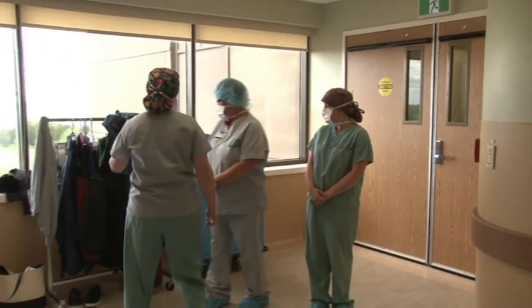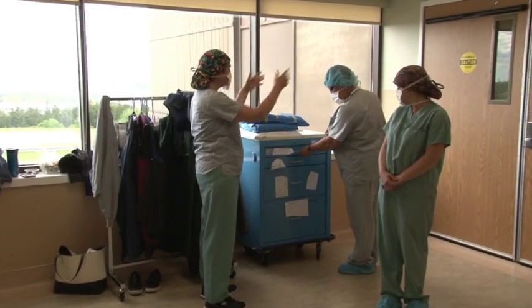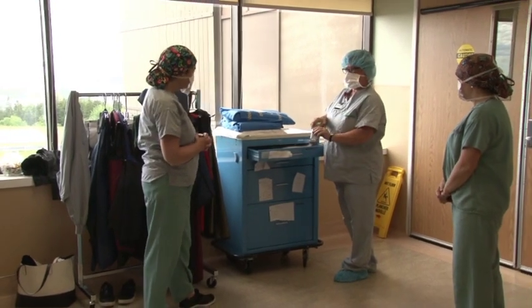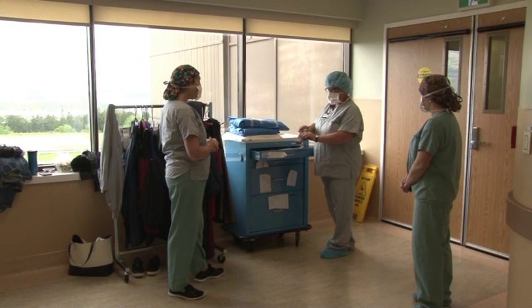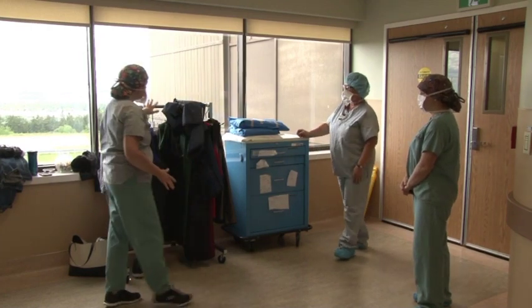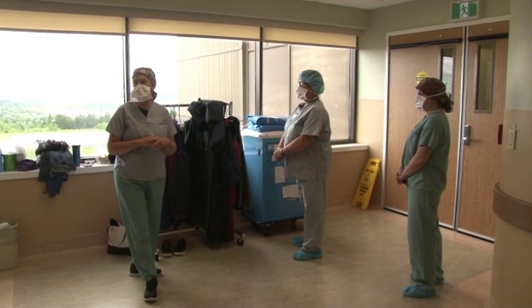And this is where we keep a temporary cart that can be taken out to CC or 5A North. And we have all of our supplies and everything that we need in here for a temporary pacemaker to be done at the bedside. I had education on this yesterday. Oh my gosh, wonderful. Oh, so all of our supplies are here. We keep it right at the door so the 5th floor can come in. This is also where we keep all of our leads when we have a procedure going on.